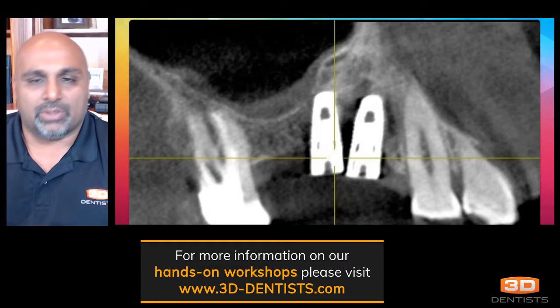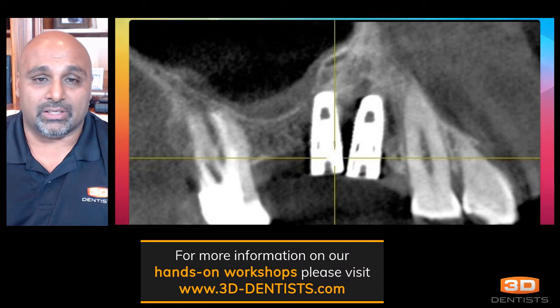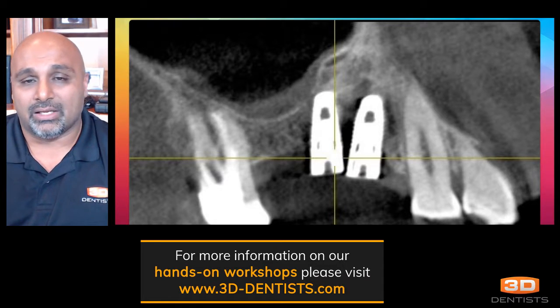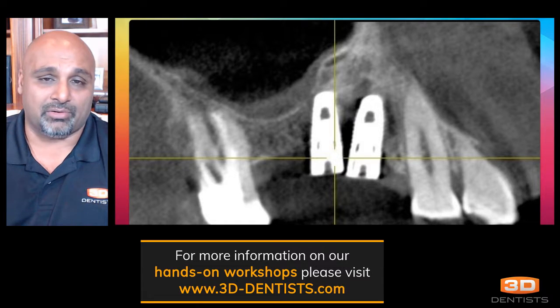Now, I always like to say that one of the pitfalls of guided surgery, or the limitations of guided surgery, is totally based on your plan. And what I mean by that is that, if your plan is not correct, your final result is not going to be correct.